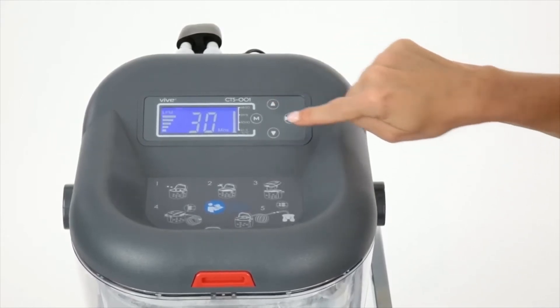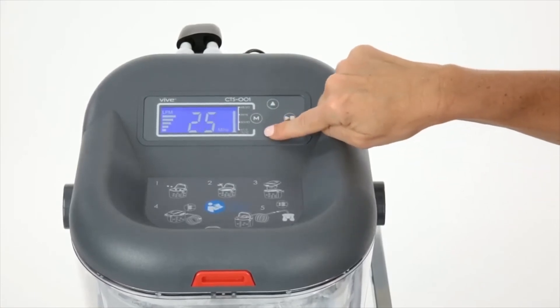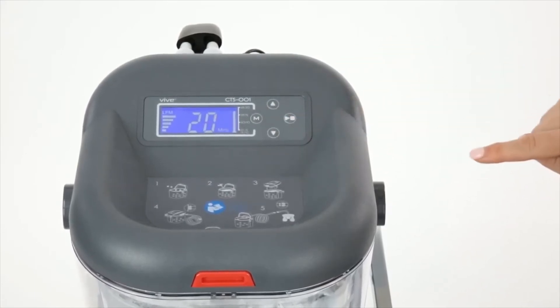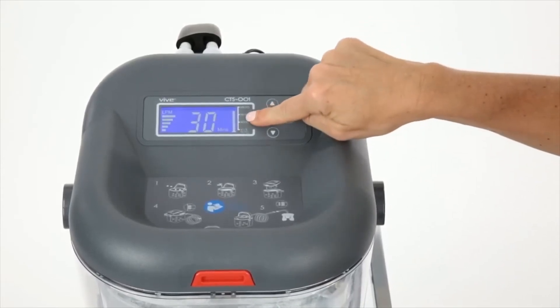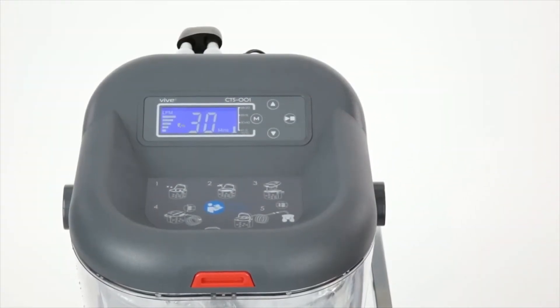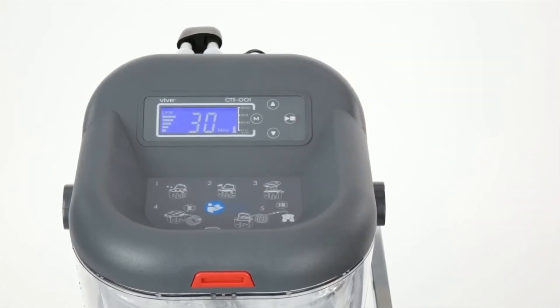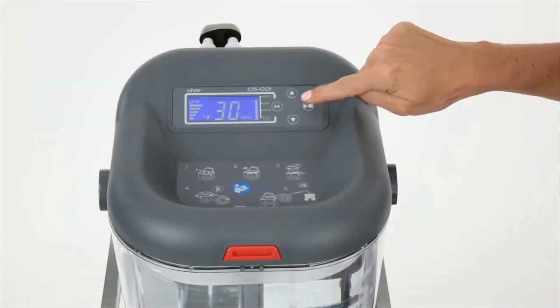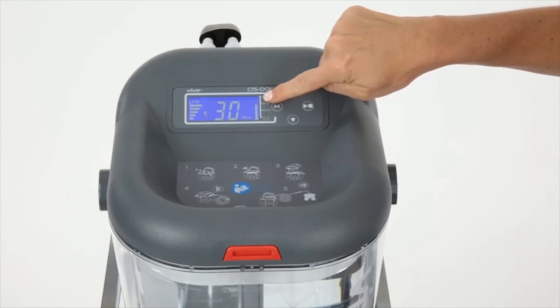To change the minutes, press and hold the M button. To confirm your settings, press the M button again. To begin cold therapy, press the start button. The fan icon means that the water is circulating. To stop the cold therapy, simply press the button again. If the machine beeps three times, that means that more ice should be added to the device.